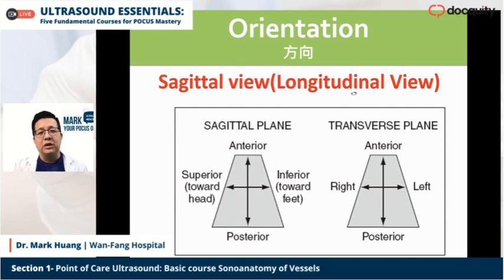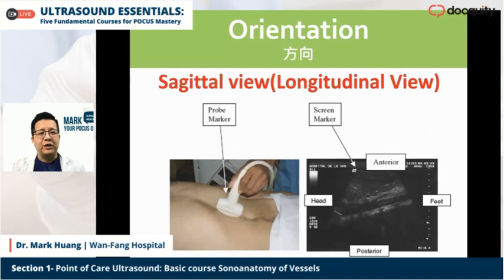When you see the screen, on your left side is the patient's right side, and on your right hand is the patient's left side. Okay, just like the CT scan. So please try to connect the image with the correct orientation. Let me show you the pictures.